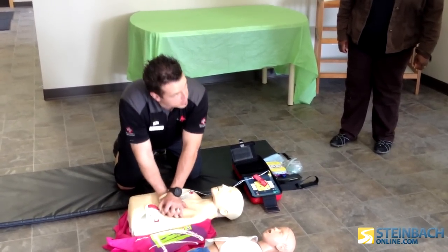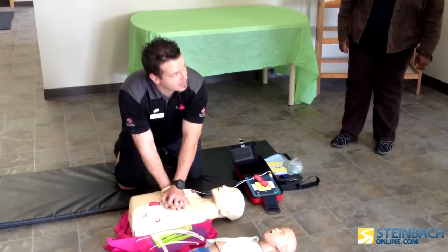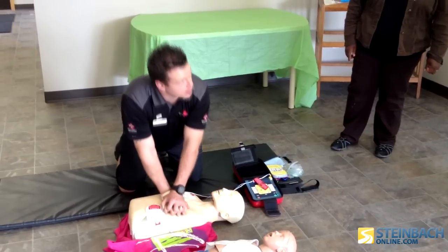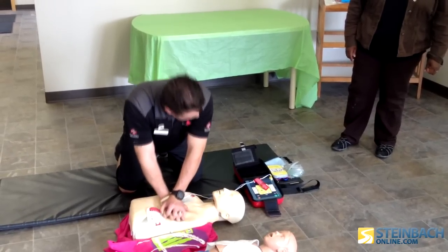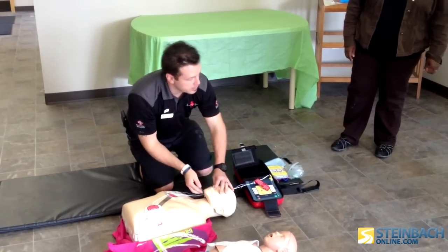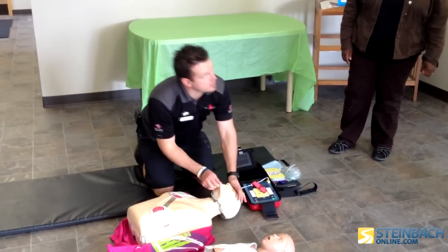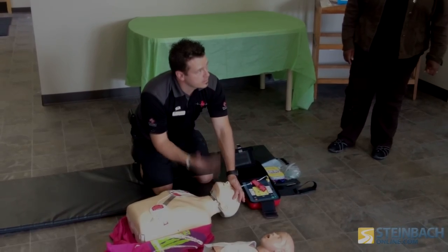How many compressions are you supposed to do? 30. The AED will count for you. Lift nose, tilt head, and give two full breaths. Put your breaths in. That's fantastic.